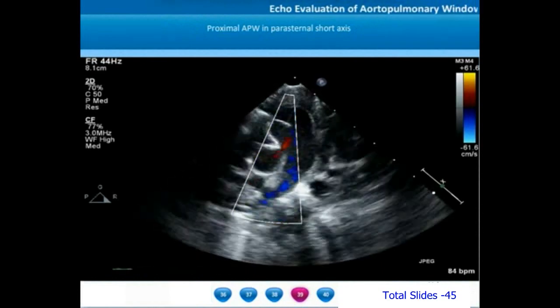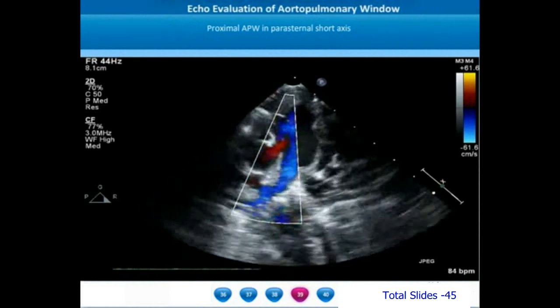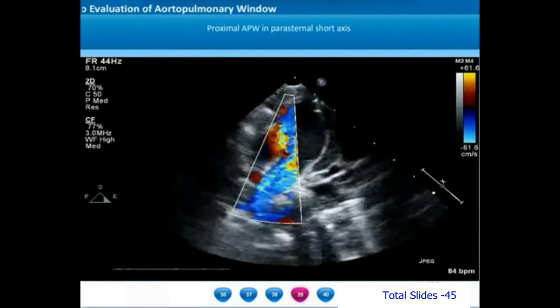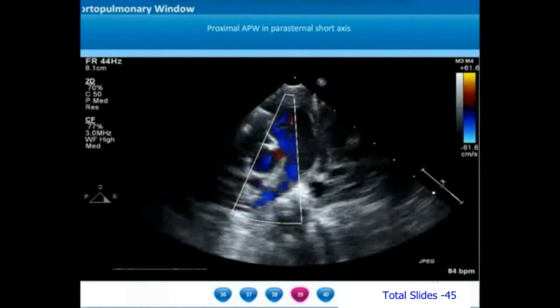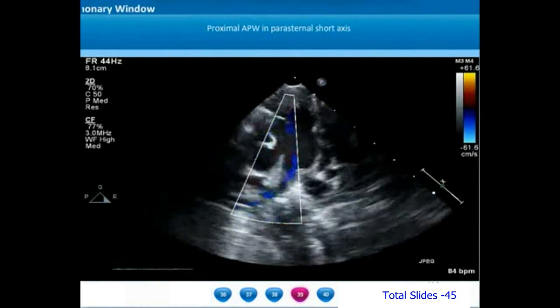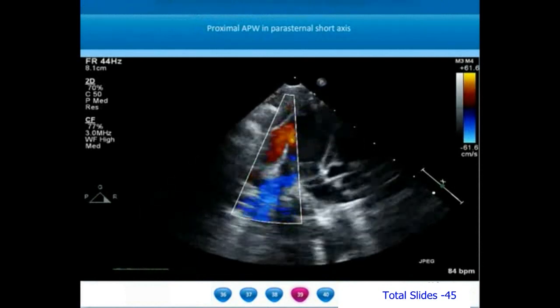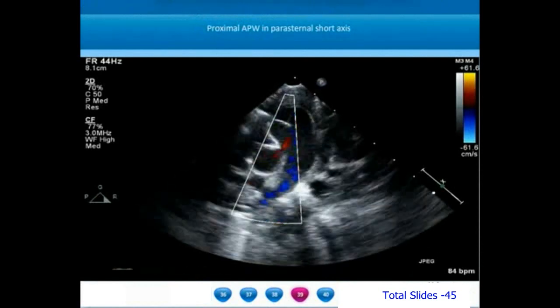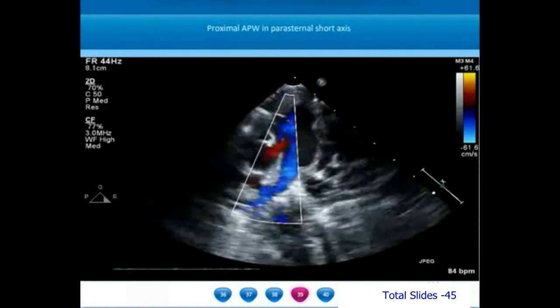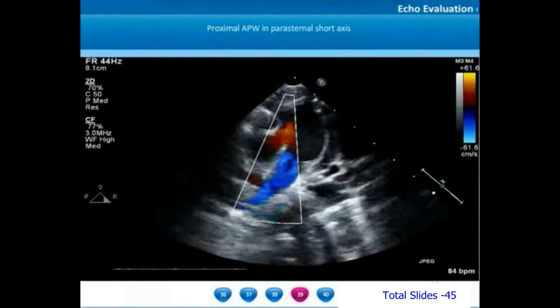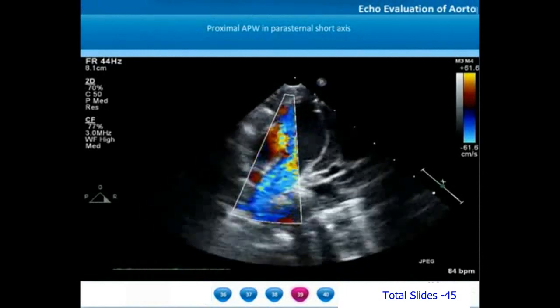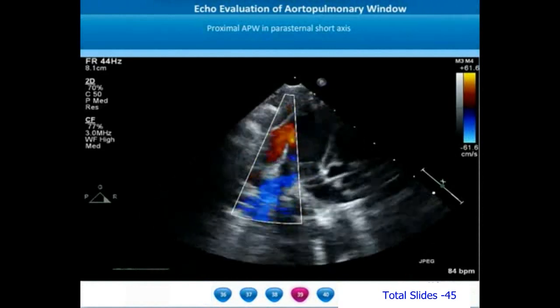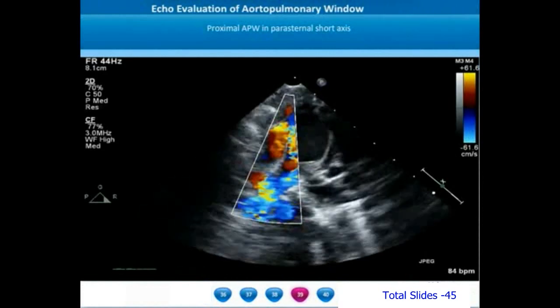We can see a large left-to-right shunt from the ascending aorta into the main pulmonary artery. The main pulmonary artery is dilated due to pulmonary hypertension, and the flow from ascending aorta to main pulmonary artery is totally left to right. We can appreciate the red color flow, and the pulmonary artery branches are clearly arising from the main pulmonary artery.